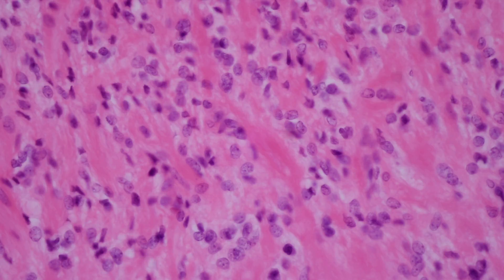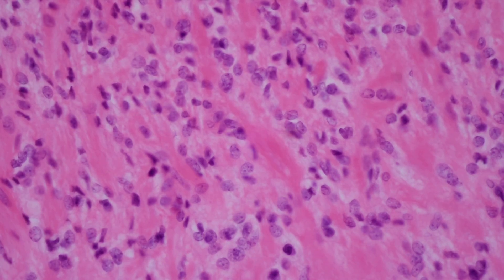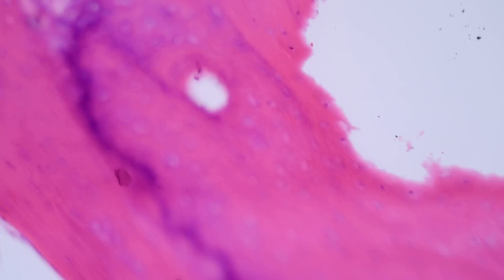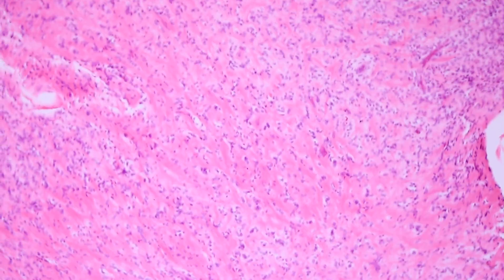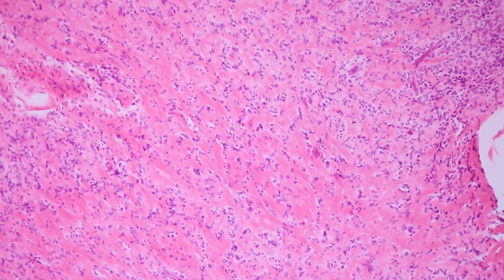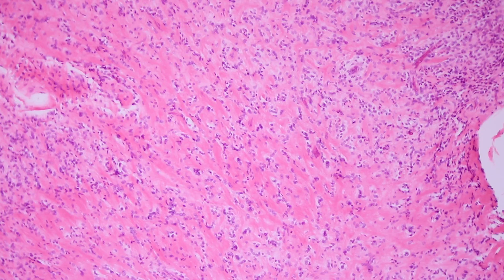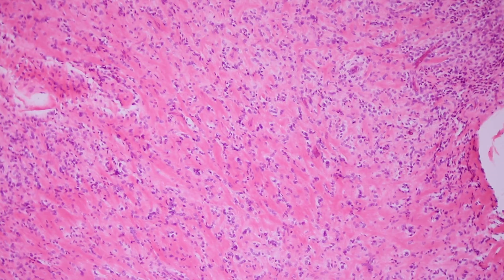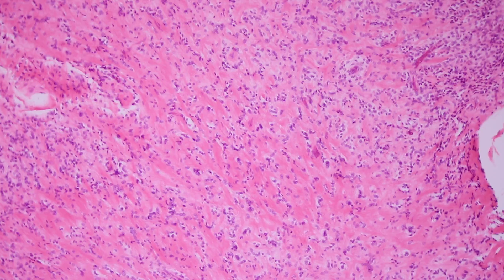I'll include links to papers in the video description giving criteria for deciding malignancy or atypical features. Again, we have this peripheral shell of bone, and the central part of the tumor has round, oval, or spindled cells arranged in sheets or in long rows — we call those cords or trabeculae. The background can range from fibrous to myxoid as the name suggests; sometimes there's very dense pink sclerotic collagen, other times abundant blue myxoid material.